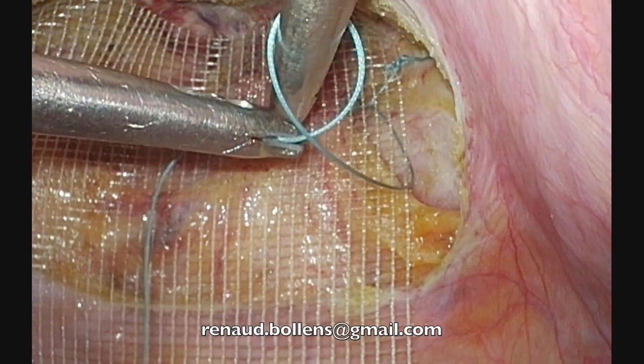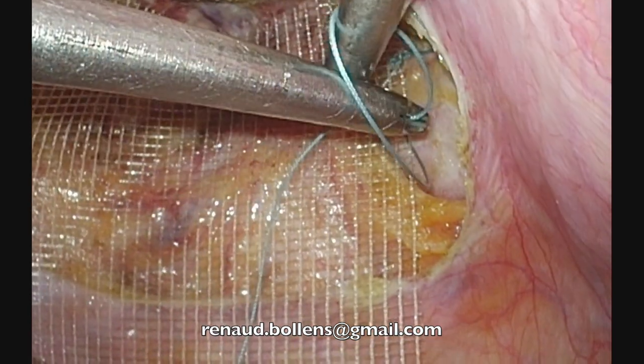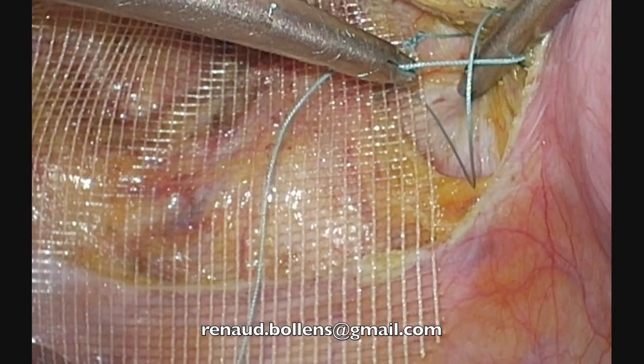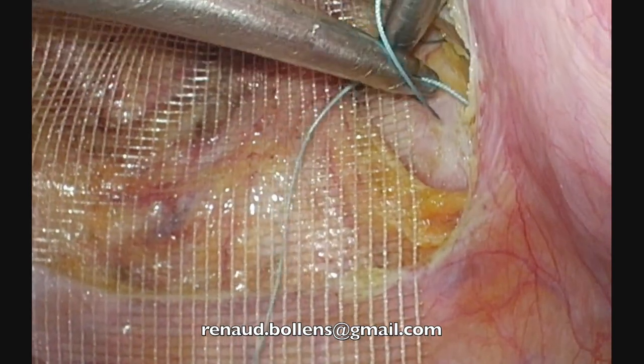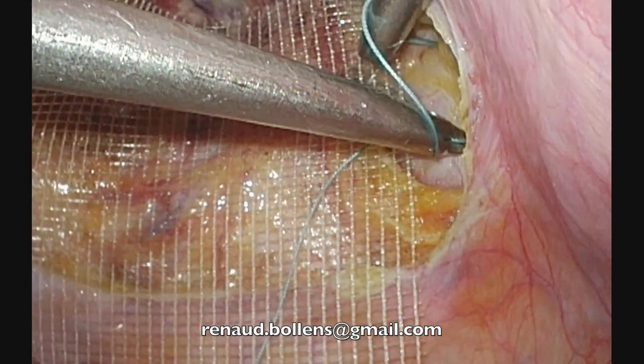But to maintain the half loop, you have to move the two hands together. If you move just the right hand, you have a half loop here, then now it became a full loop. Then don't forget to move the two hands together. Then it's still a half loop. I catch the short thread.